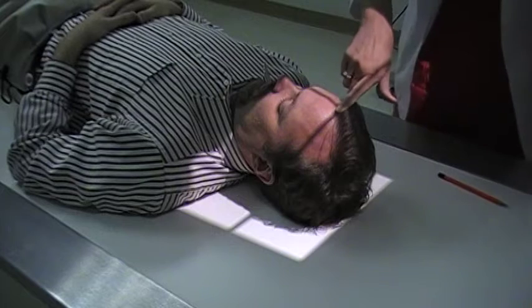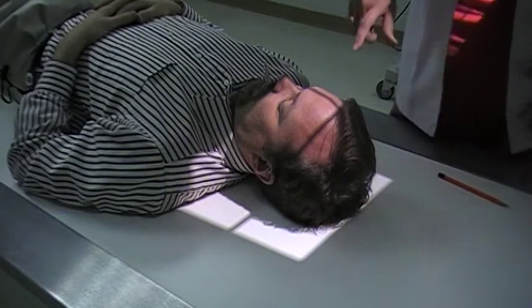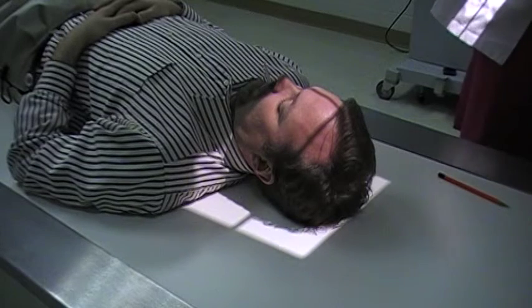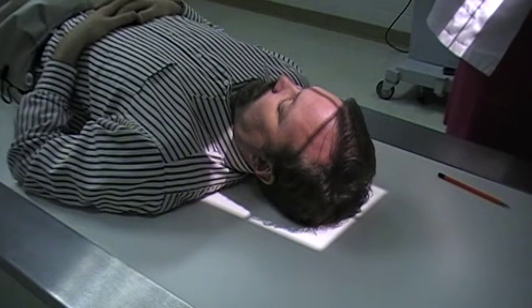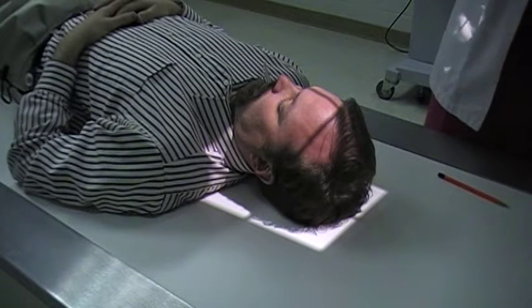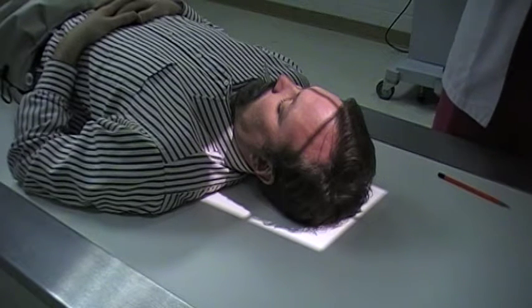Okay, and then our central ray is going to enter 2.5 inches above the glabella. Now I'm using a 10 by 12 or 24 by 30 centimeter image receptor for the cranial x-ray. Okay, so that is our Towne method.